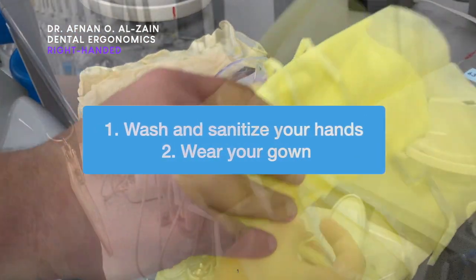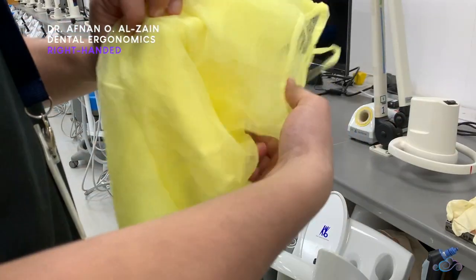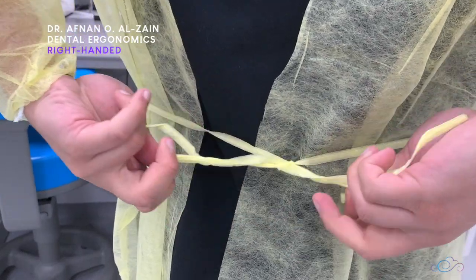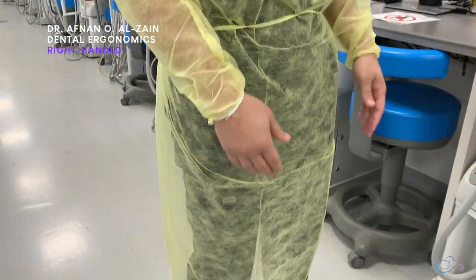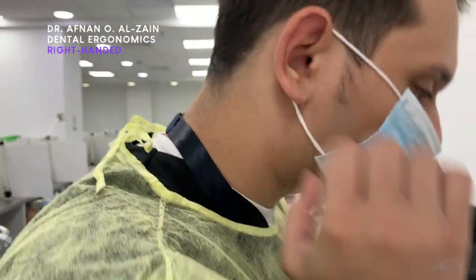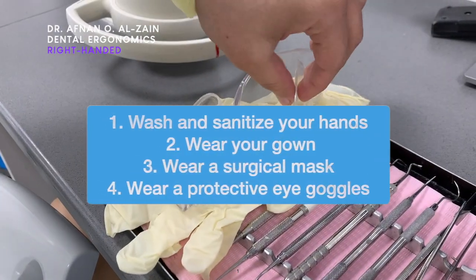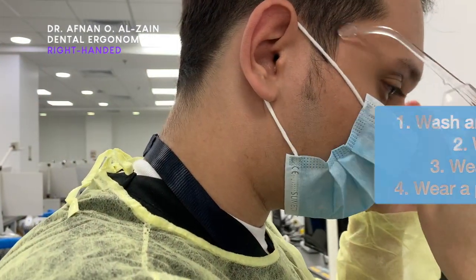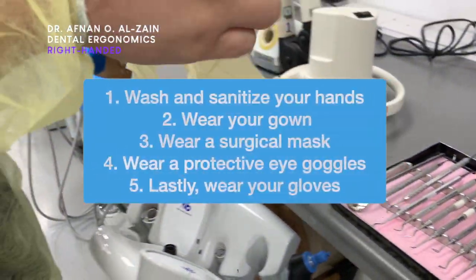Then you will wear your PPE, starting with your gown, then you will wear the surgical mask, then you will wear the protective eye goggles or face shield, and last but not least you are going to wear your gloves.